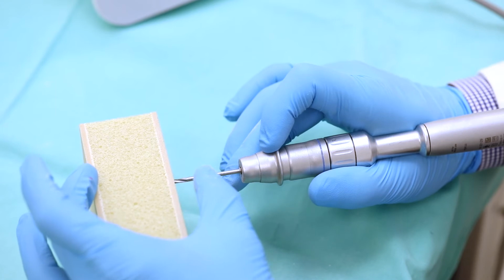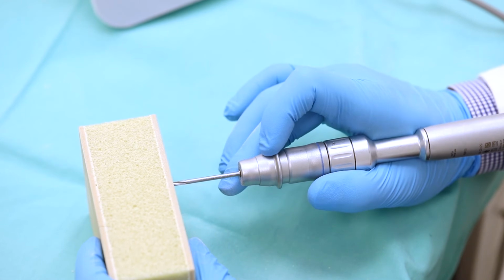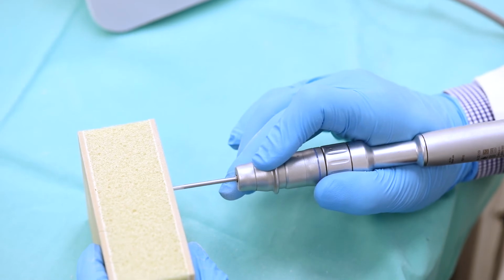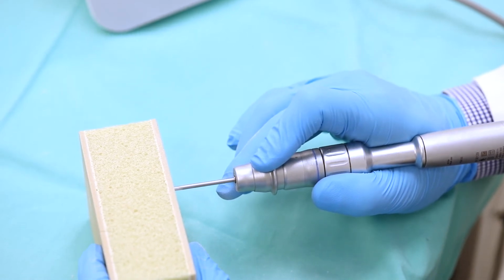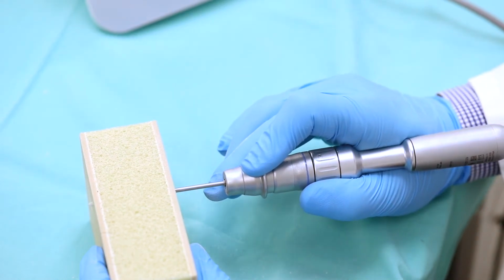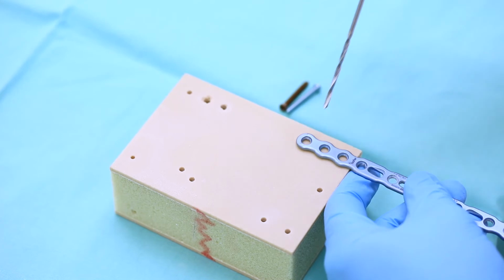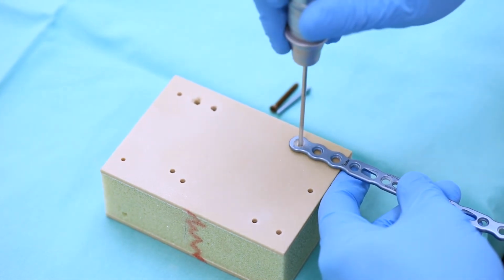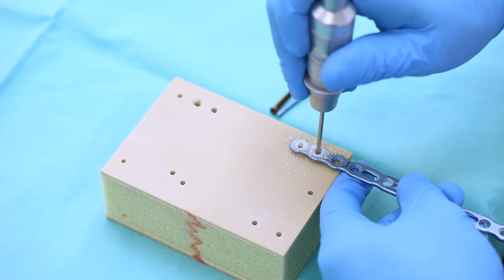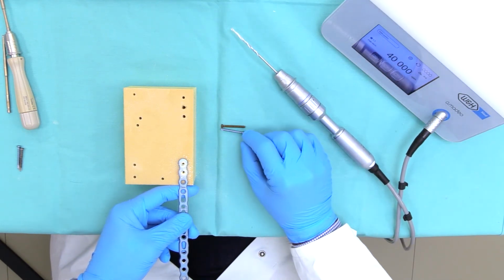As a surgeon, I feel the distal part of the bone, the distal cortices. It is essential not to press too much against the distal cortices. By using conventional screws, it is more likely that the screws will dislocate.